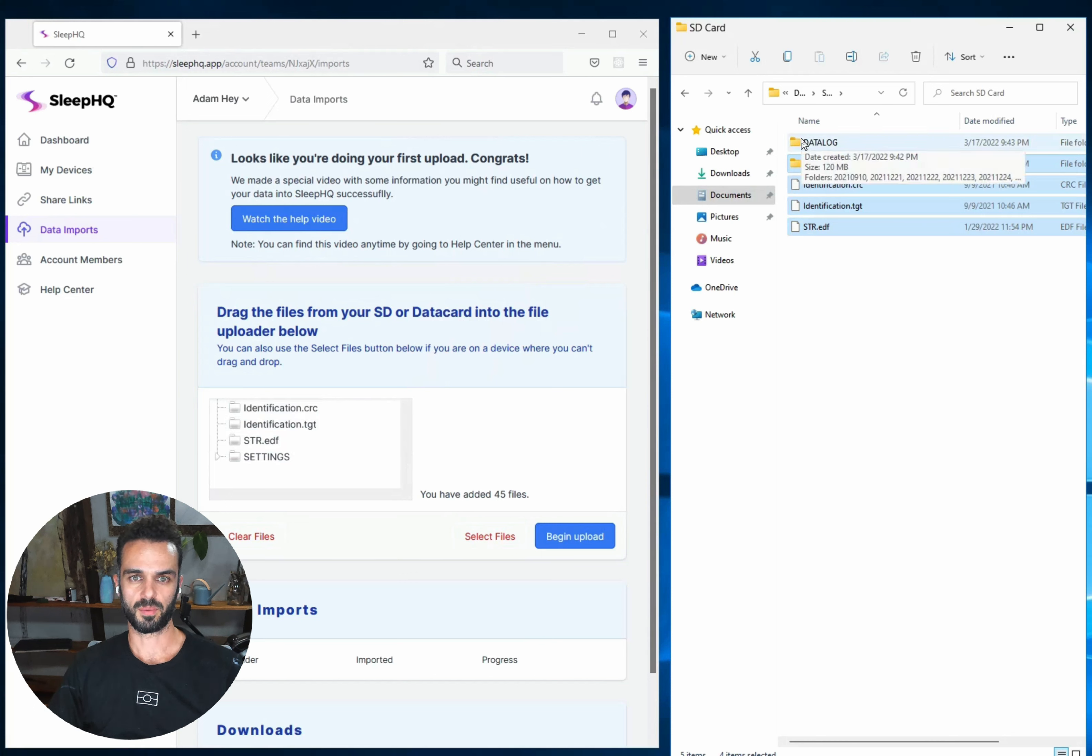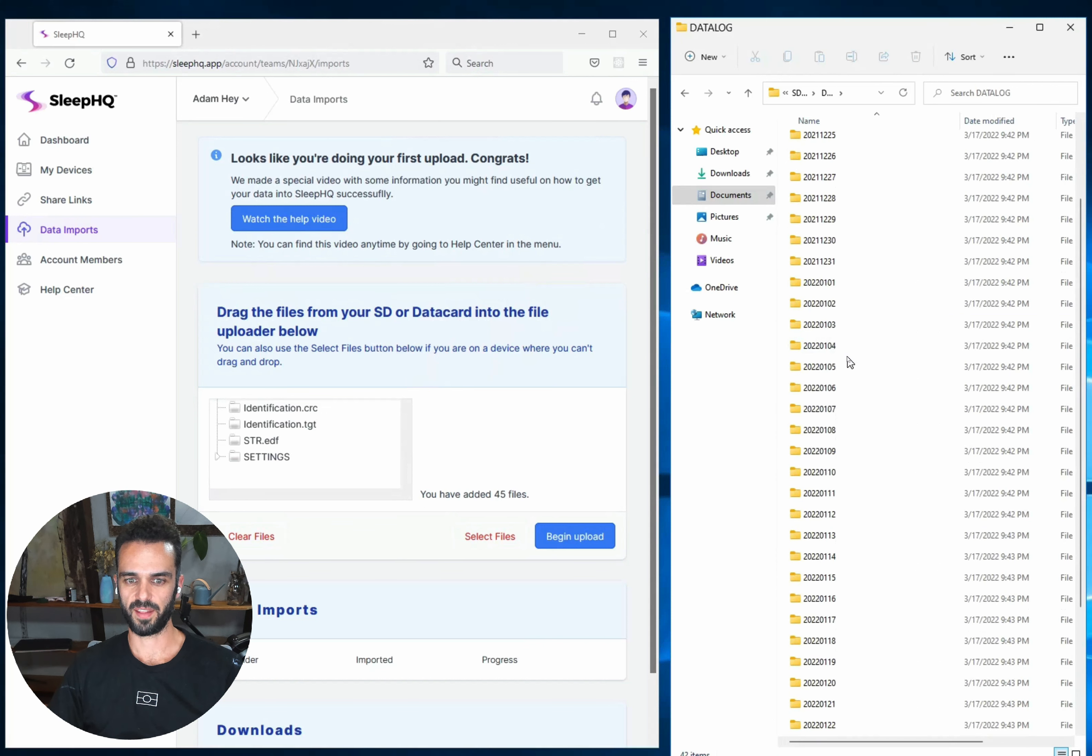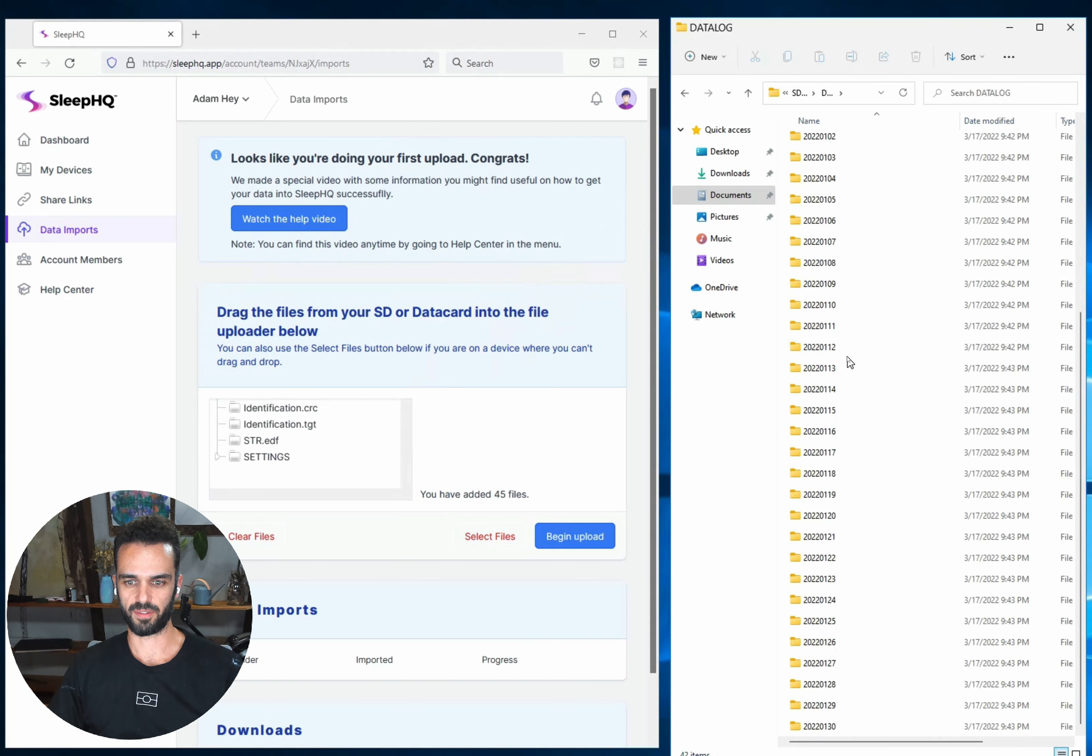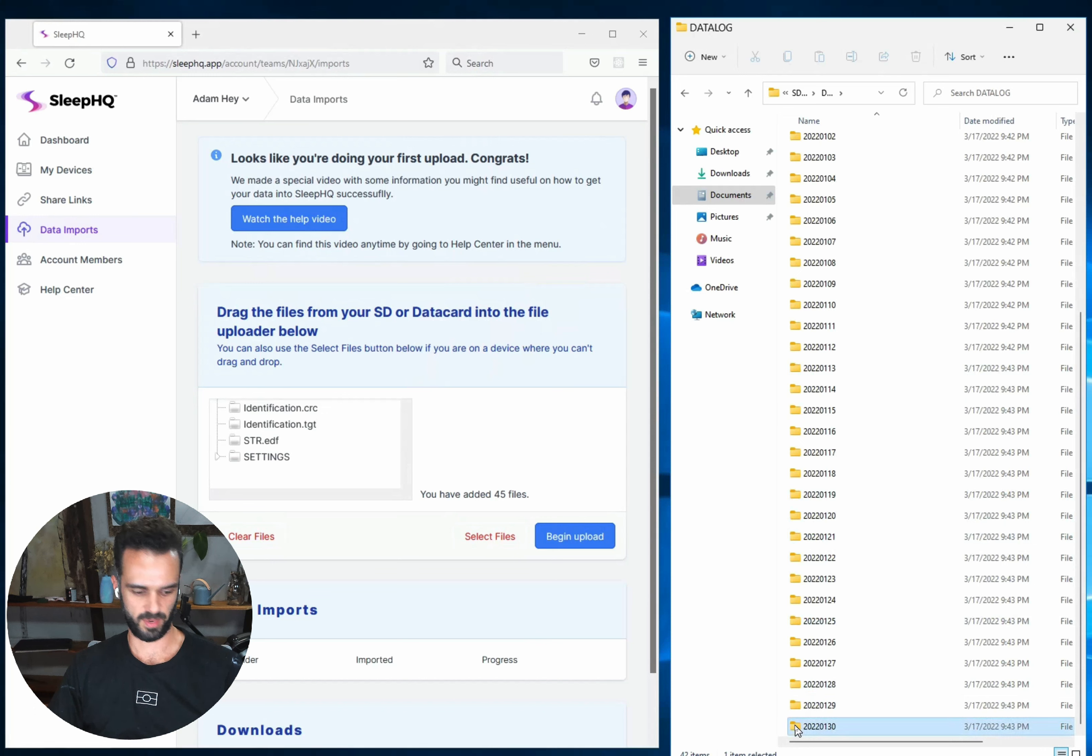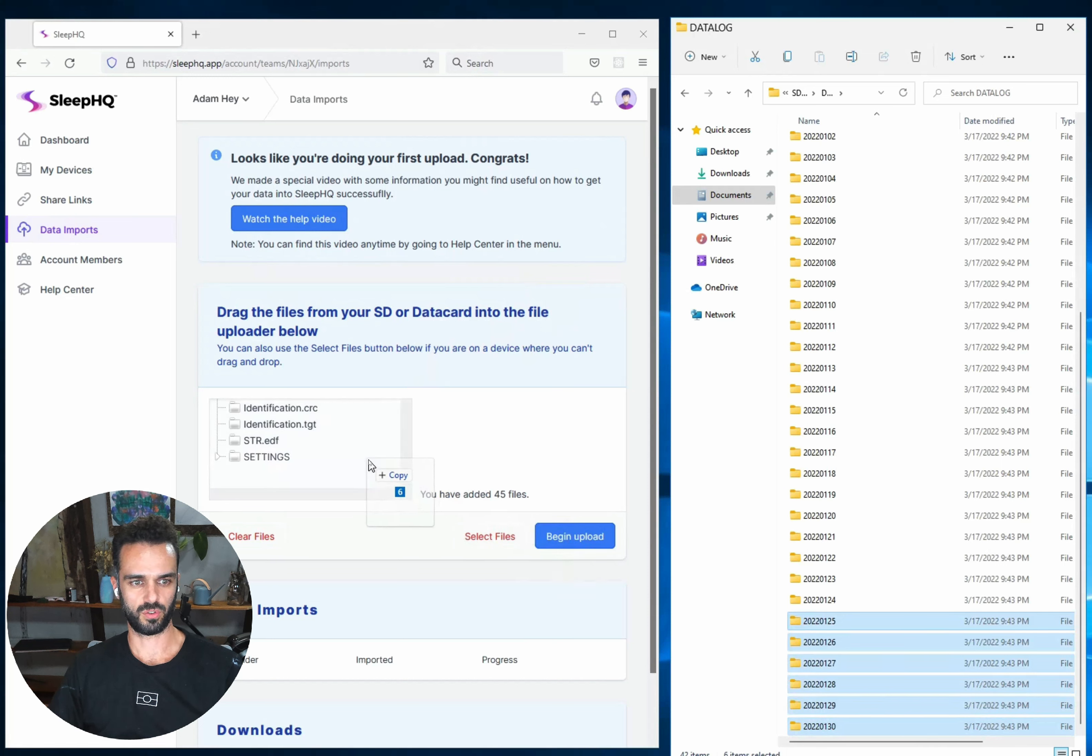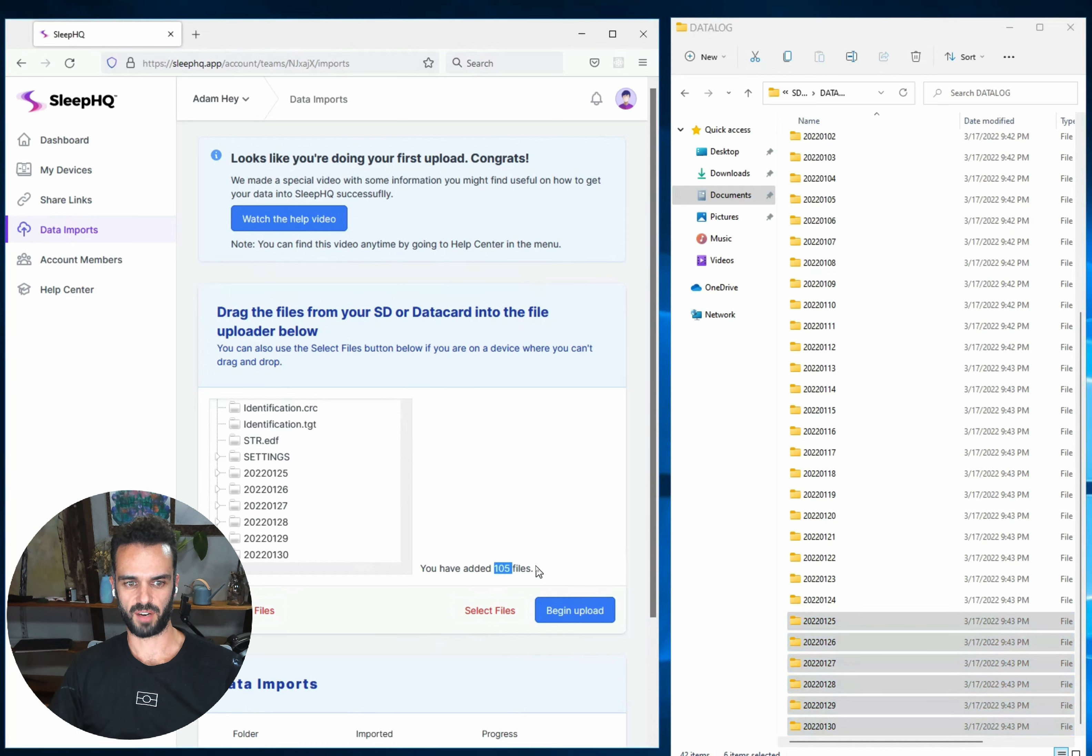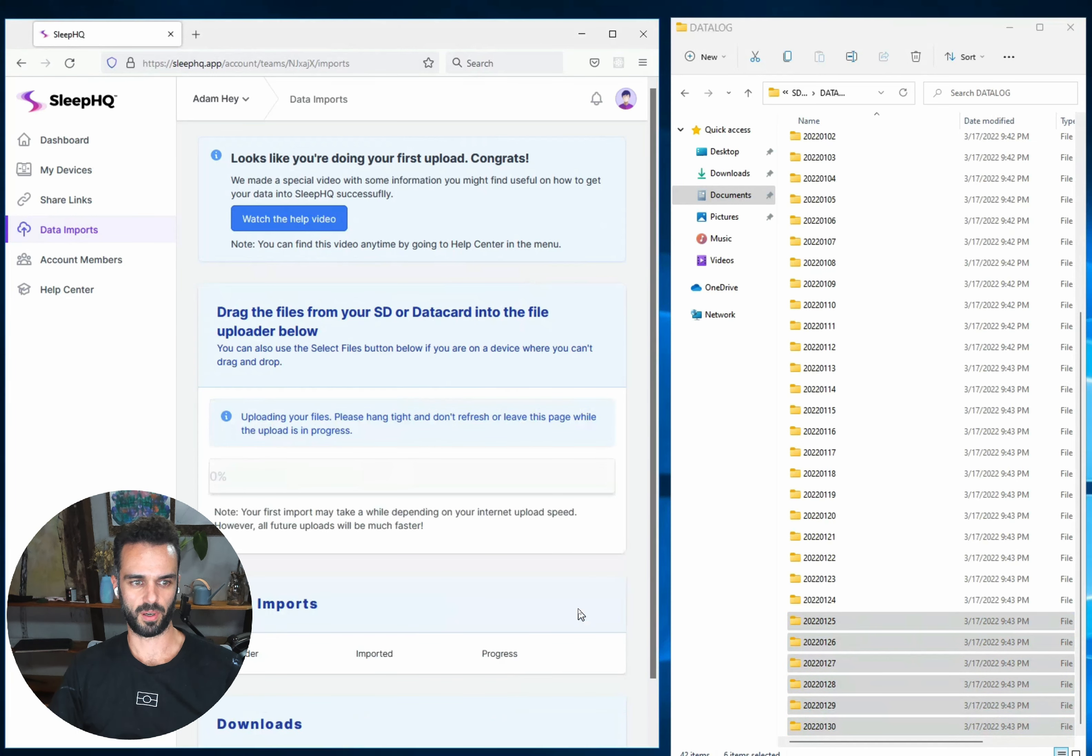Now what I'm going to do is I'm going to go into my Datalog folder and there's a folder in here for every day that I've used my CPAP machine. So I'm going to go down to my most recent data and I'm going to select the last six days worth of data. And I'm going to drag that in like that. And now it's telling me that I'm uploading 105 files. So once I'm happy with that, I can say begin upload.